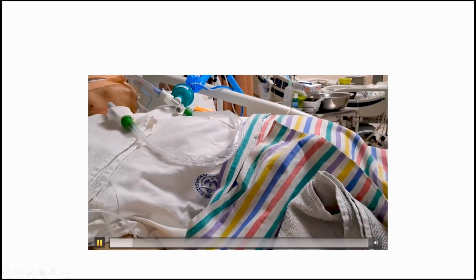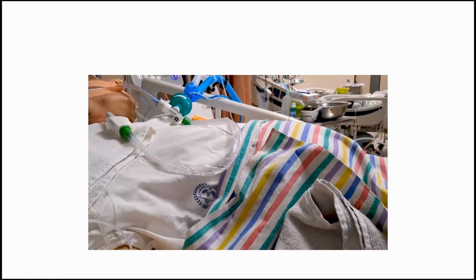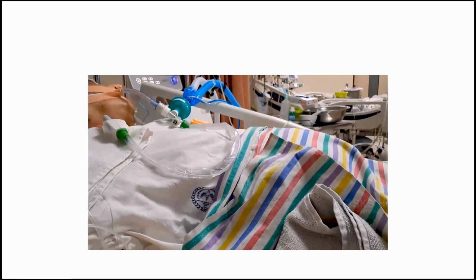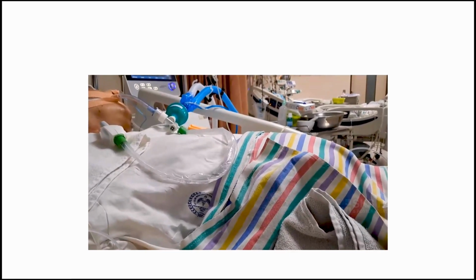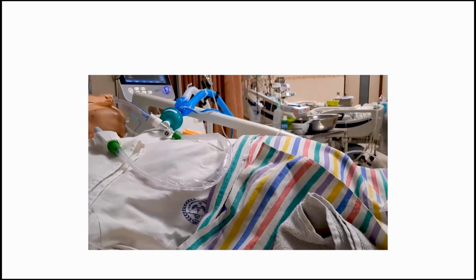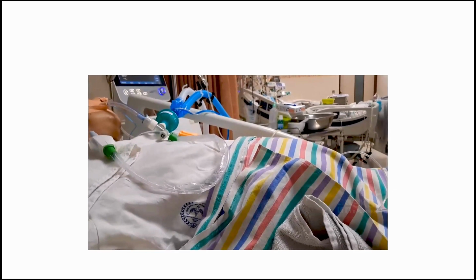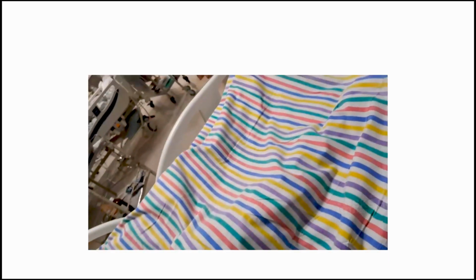The anesthetist may clearly recognize this when you induce a patient or give say 50 or 75 mics of fentanyl before your anesthetic, the breathing becomes more active. So this active exhalation and increased muscle tone prevent any mechanical breath from going through, and only the spontaneous breaths go through, and it can cause what you call reverse triggering.